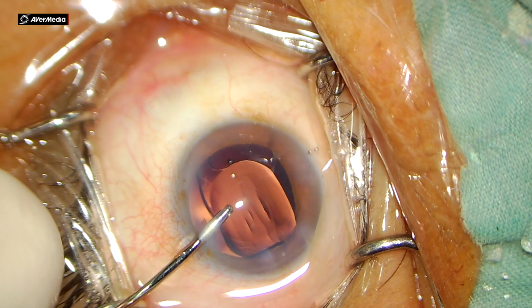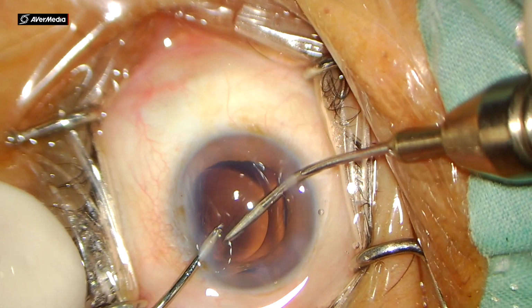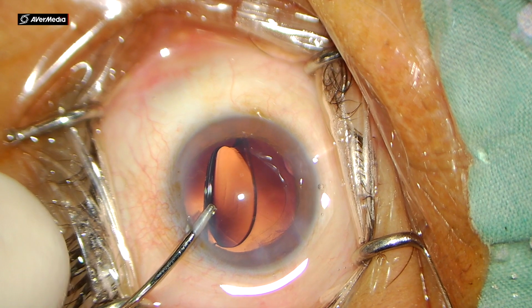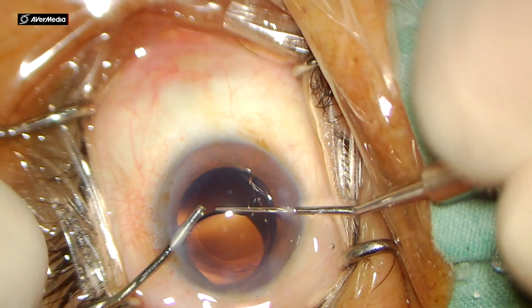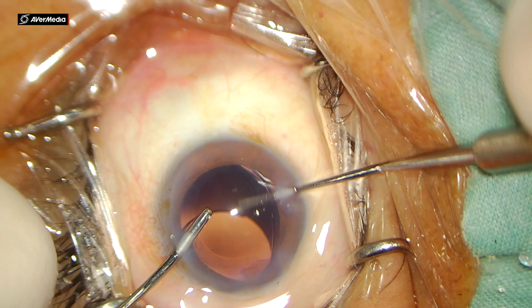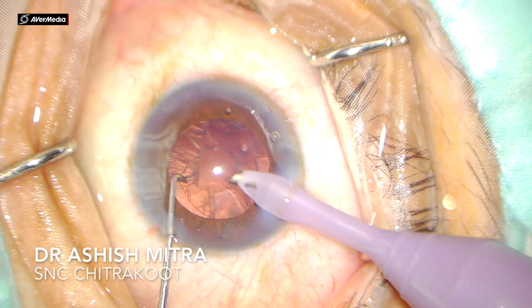Now this is a video where I call IOL tantrum, because under hydroimplantation sometimes your IOL just does not behave the way you want it to behave. Now watch here, the leading haptic is actually turned, and that is what is preventing the IOL from being in the right place. Now when I pull this, just watch, the leading haptic is turned, and I would just make it straight, and now you can easily implant the IOL in the bag. So sometimes your IOLs give a lot of tantrum.